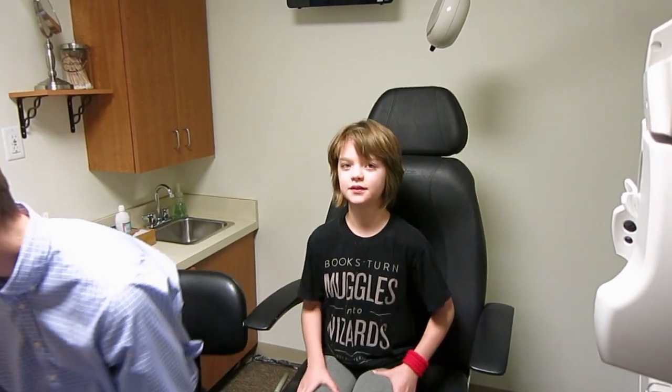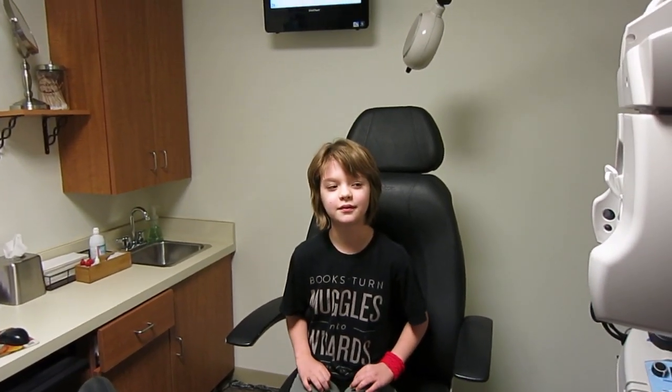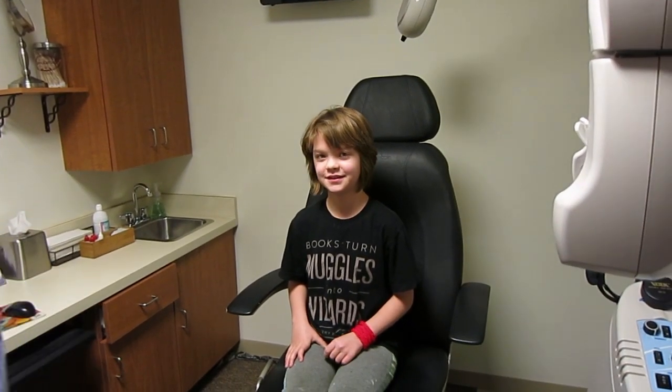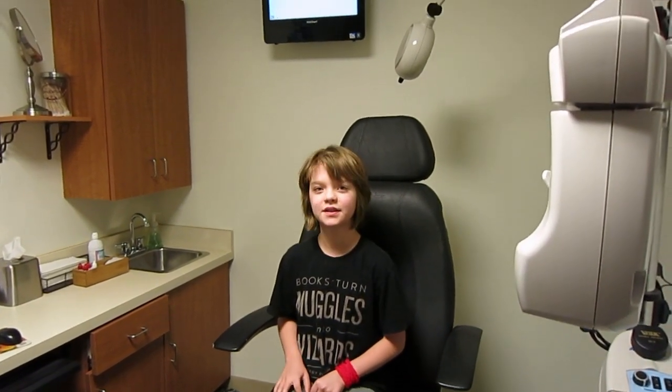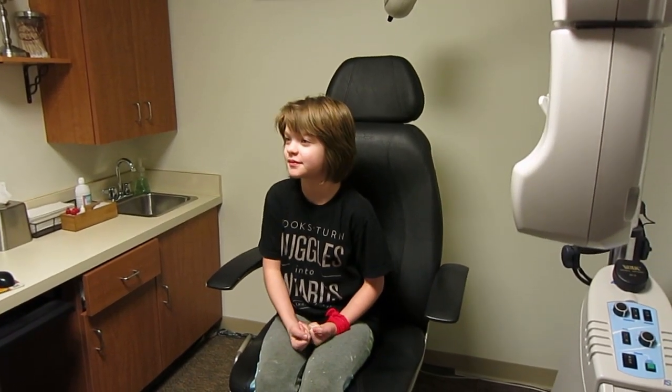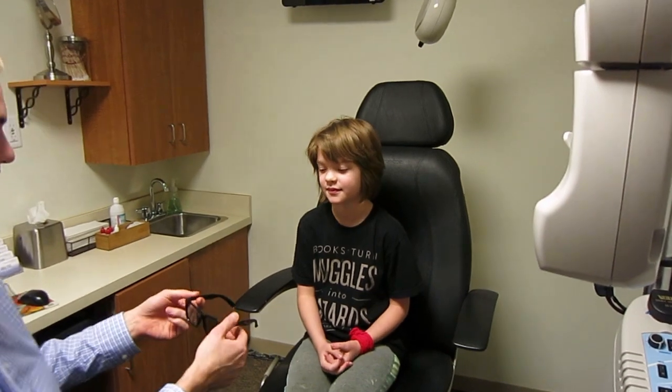A lot of people can't read those numbers — that's a surprisingly large number of people, especially men. They see those colors as the same color, so instead of a 28 they'll just say a 6 because the other one's hidden. It's kind of cool.